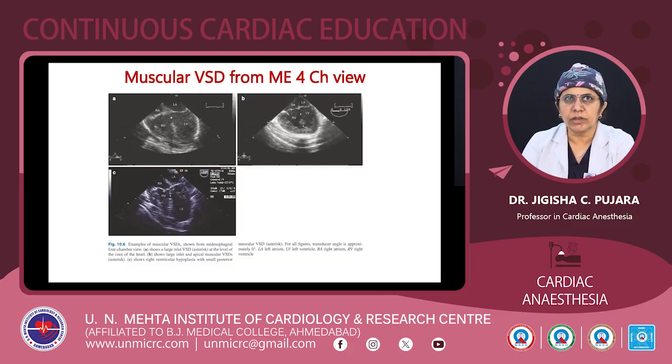Here you can see the muscular VSD from the mid-esophageal four-chamber view. Figure A shows the inlet VSD, here in the asterisk at the level of the crux of the heart, and figure B shows the large inlet and apical VSD. There are two asterisks. Above is the inlet VSD and downward is the apical VSD.